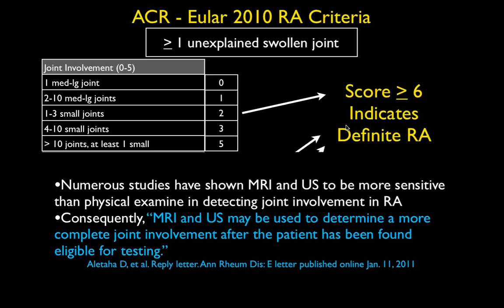Does that mean you're going to image? How do you decide what joints to image then? Yeah, that's good. That's a question. I don't have the study here.